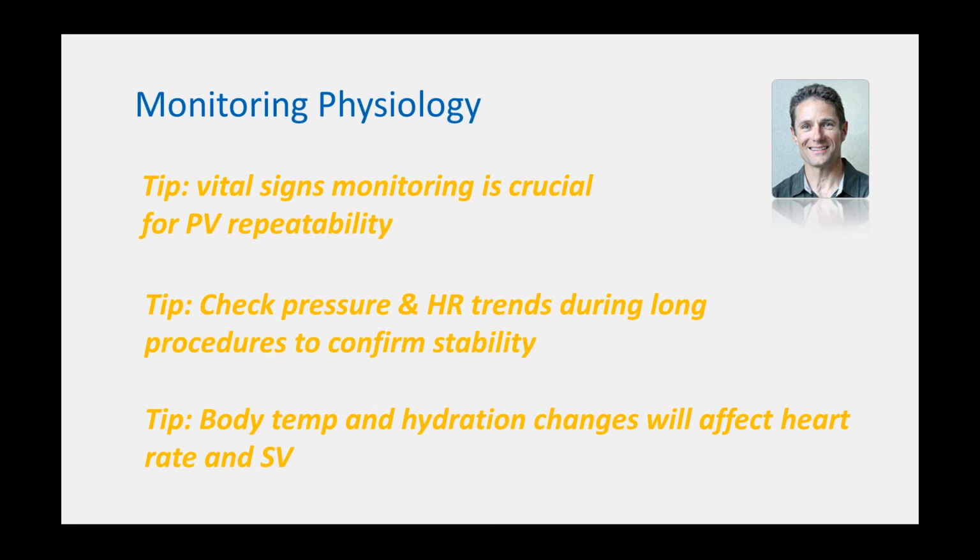Again, Philip had mentioned earlier about doing blood gases and looking at metabolic acidosis, and those things also will change. We occasionally use an iStat with cartridges to do that. For the most part, we've been doing a lot of our models long enough and don't have a lot of problems with those, and we find if we keep end-tidal CO2s in the right range, all of our blood work and blood parameters come back in the normal ranges as well.